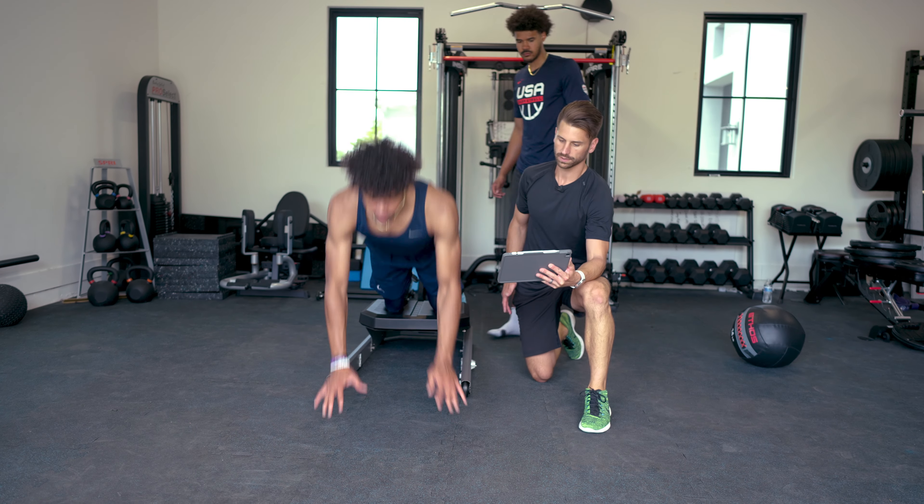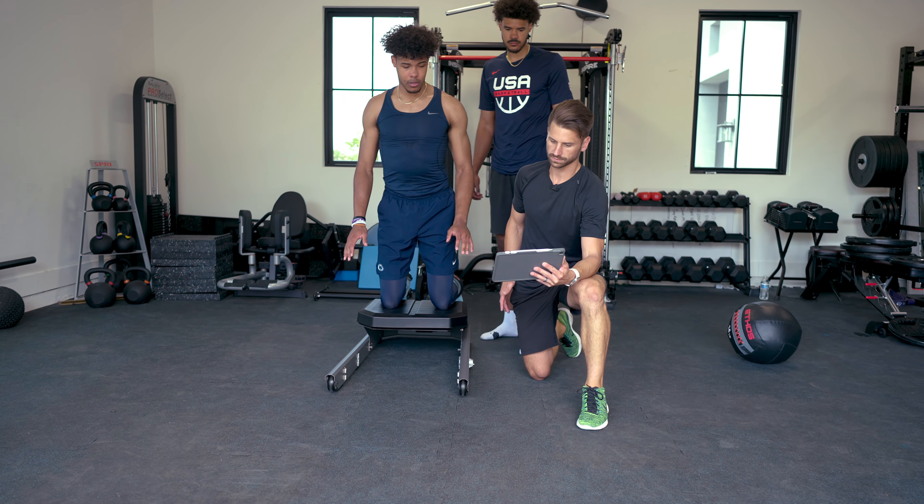The second part we do is we want to compare events population. Every population — male, female, and certain sports — have certain force outputs that we want to compare to.